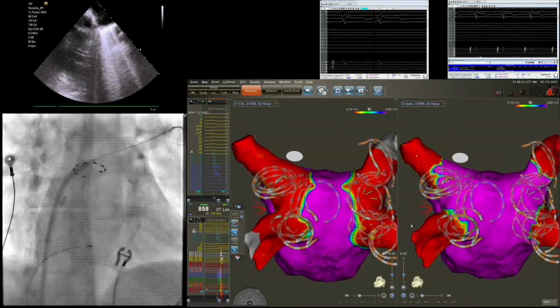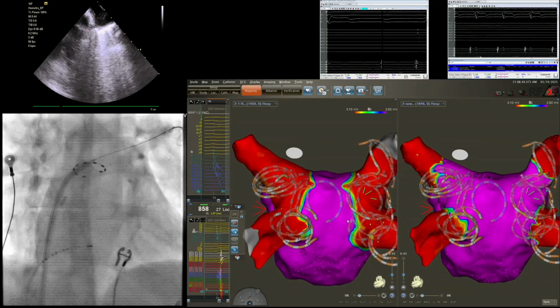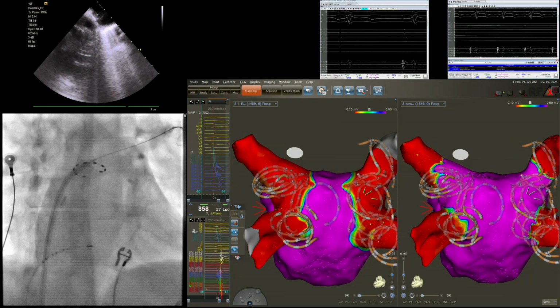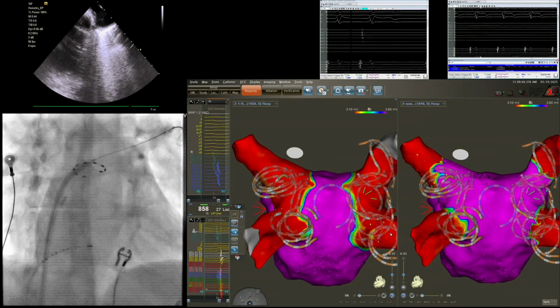So actually, if we have persistent AFib patients, I can easily put with this anchoring, even from the left or from the right side, I can cover the posterior wall, okay? So this is the aspect, I think that it clearly could be done, and we did it actually in one patient, okay? So if no questions, I need to just move and jump to my recorded case.